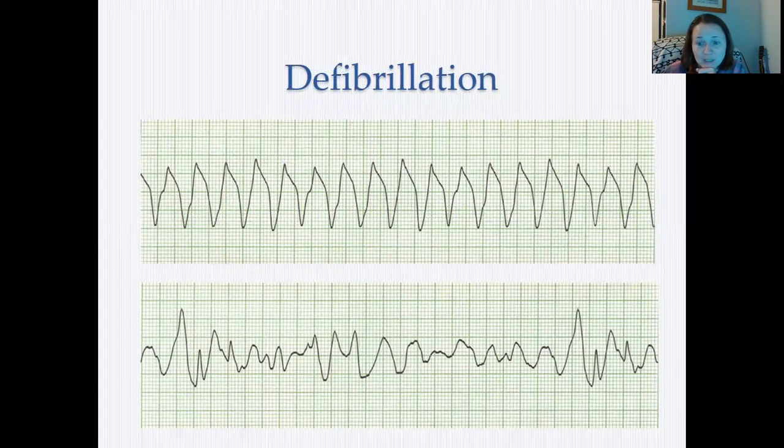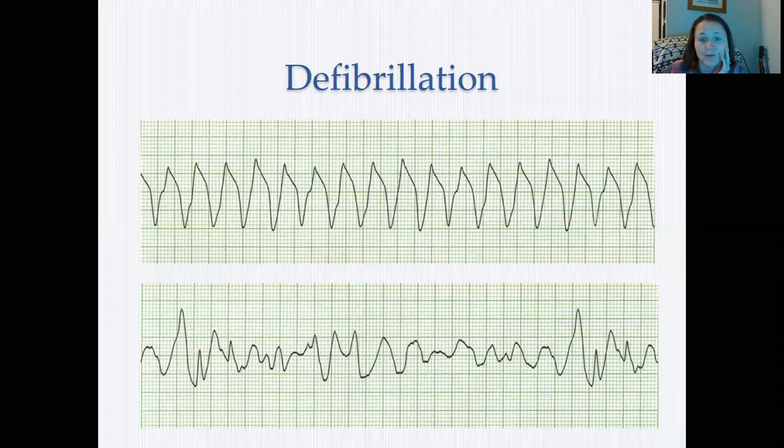All right, so we've talked about chest compressions. Let's talk about defibrillation. So remember the difference in defibrillation and cardioversion. Cardioversion with a pulse, defibrillation without a pulse. So they must have no pulse, no organized electrical activity that's leading to perfusion. Both of these rhythms here have to have electrical activity, okay? So let me get my pencil. I'm going to change away from purple. It seems inappropriate. Let's do red.